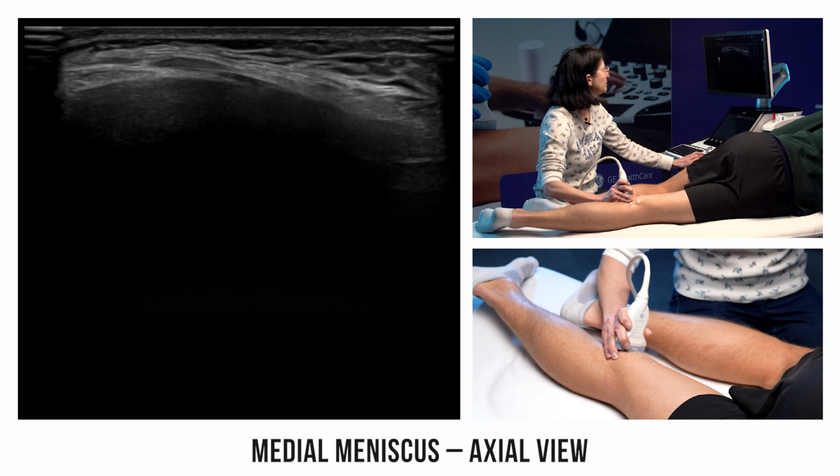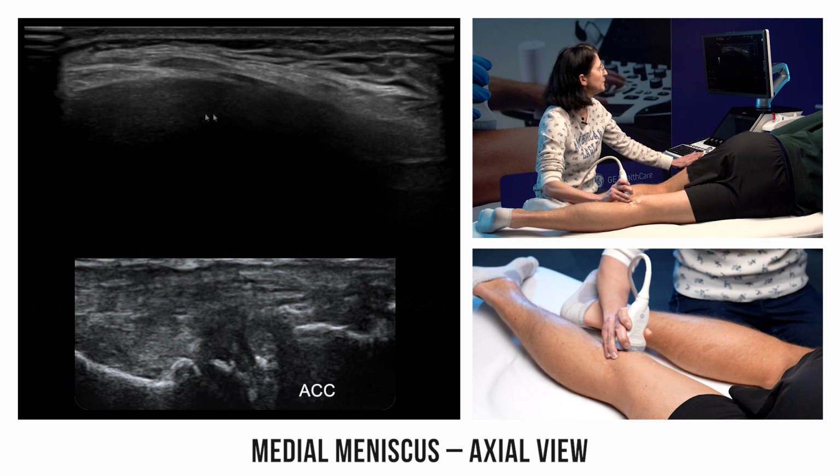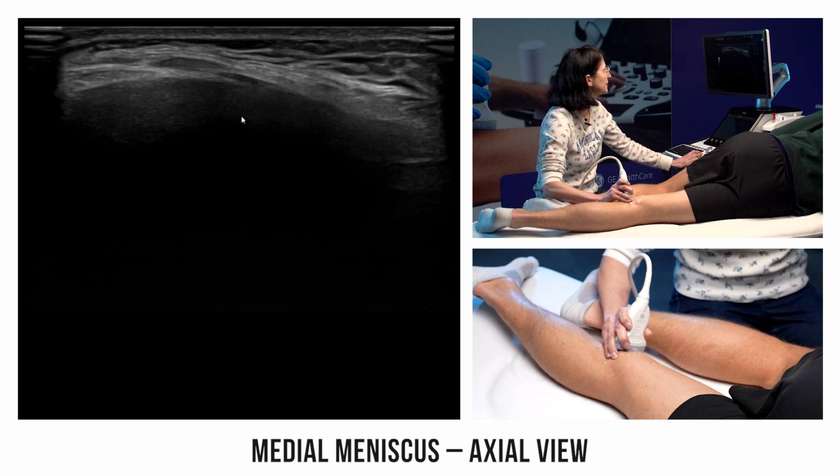This view is less informative, but it can sometimes be an elegant way to show small calcium deposits inside the meniscus, and, if there is a cyst, to more easily show the tears that are feeding it.